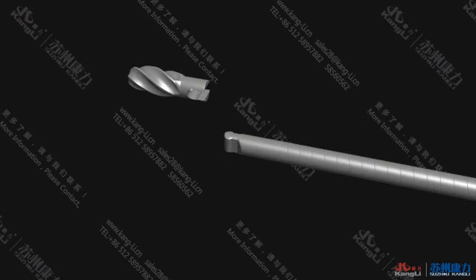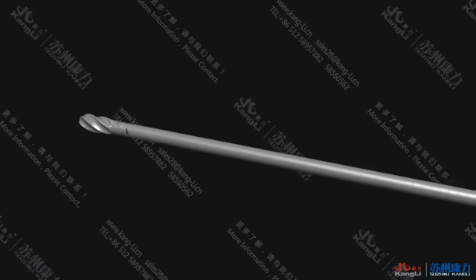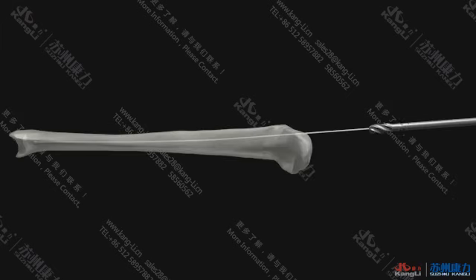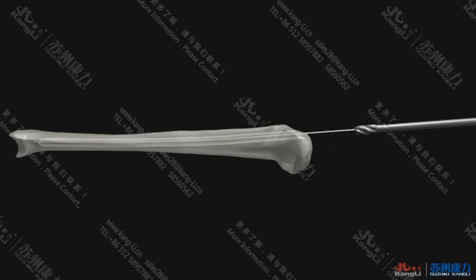Install the soft reamer on the drill and insert the ball guide pin to ream clockwise. Gradually increase the soft reamer from 7.5 millimeters. After reaming, remove the soft reamer clockwise. Leave the ball guide pin unremoved.